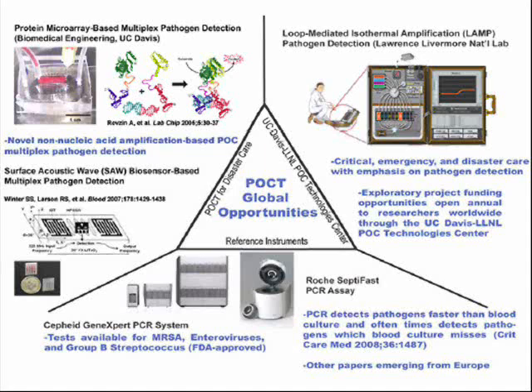Whole blood samples are pre-processed using dielectrophoresis. This will purify out any pathogens of interest. The pathogens are then pre-concentrated onto a microarray containing antibodies specific for the organisms that we are targeting. A lysis agent is then applied to release the DNA inside these organisms. DNA detection is by zinc finger proteins. These are the proteins or DNA recognition sites found on our hormone receptors. So therefore we're using nature to essentially serve as a detection system.